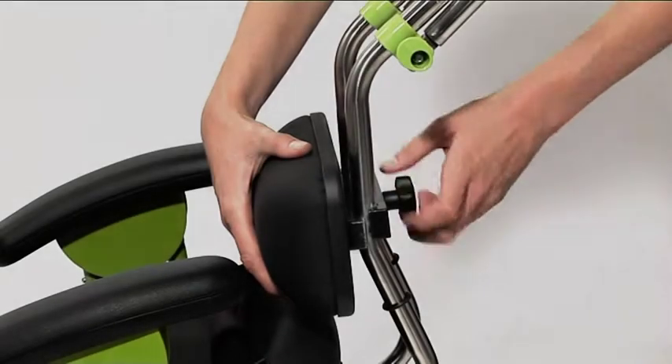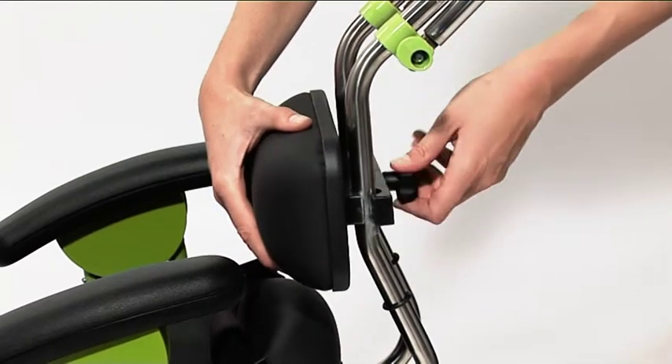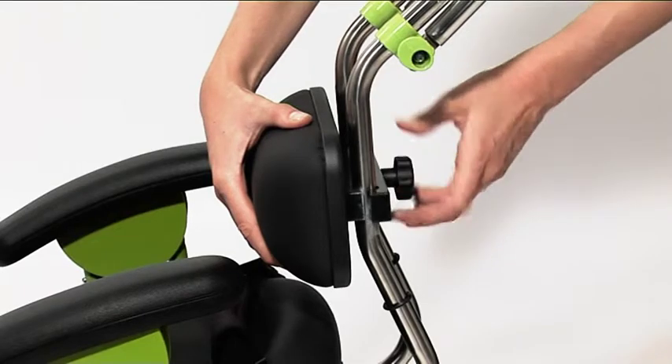To adjust the height of the lumbar prompt, loosen the handwheel. Move the lumbar prompt to achieve the desired position and then re-tighten the handwheel.